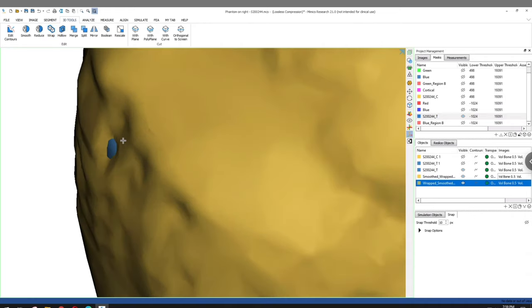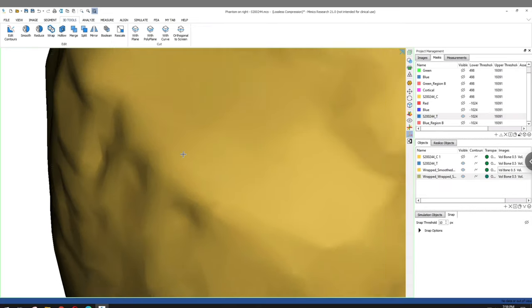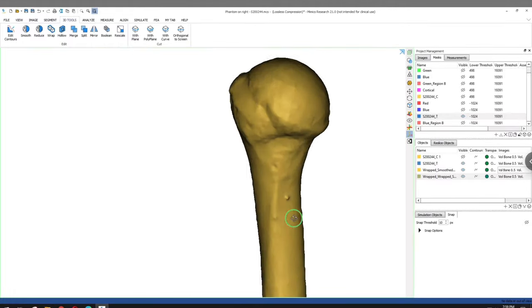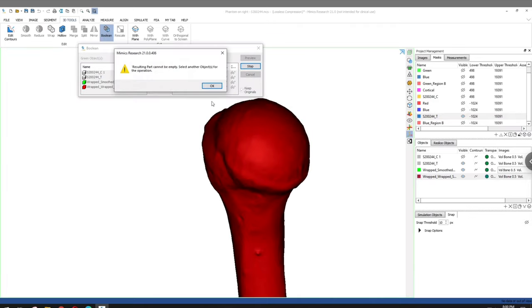Now, as it looks like we still have a little bit of an interference between our trabecular and cortical bone in this particular instance, just make sure that you continue to wrap until you have a very solid cortical shell. And this shouldn't be too detrimental to the accuracy of your 3D model here. You just really want to make sure that there's no encroachment of your trabecular interior on your cortical shell.